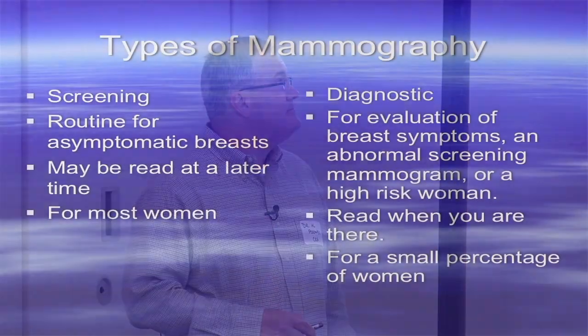And essentially, it's saying to the radiologist, look here again. You look at the mammogram, but then you put on the CAD, the computer-aided detection, and it tells you, look in these areas again, just to make sure you're seeing what the computer is seeing. And that's how we use it. The computer-aided detection does not read the mammogram, does not tell you where to biopsy. It says, look here again, and then drive on.